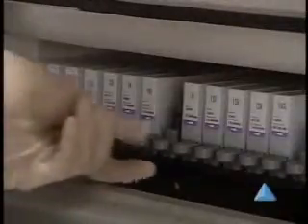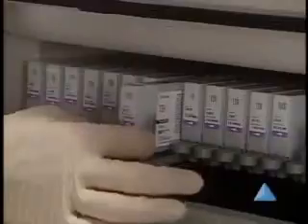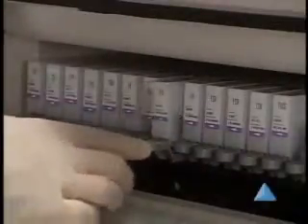Open the primary reagent door. Identify a location for the pack and then pull the reagent holder toward you. Load the pack on the reagent holder and push the reagent holder back firmly until you hear the pack lock in place. Ensure that the packs are level and locked in place by pressing down on the top front of the pack. Close the primary reagent door. The primary reagent barcode reader scans the ready packs and the inventory is updated automatically.